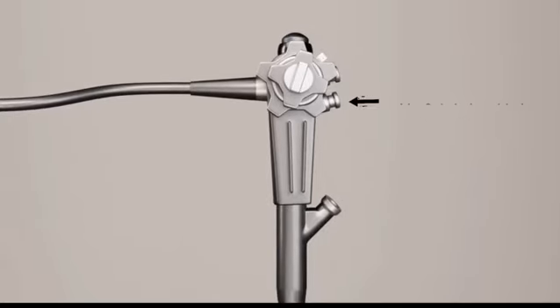Air and water valve, designed to remove coarse deposits and prevent clogging of the air or water channel of the endoscope. The non-pressurized adapter allows airflow through both air and water channels. After pressing, water is directed into the air channel.